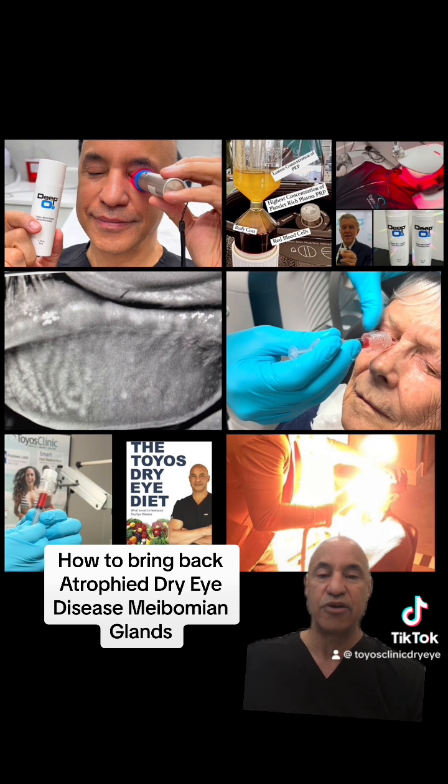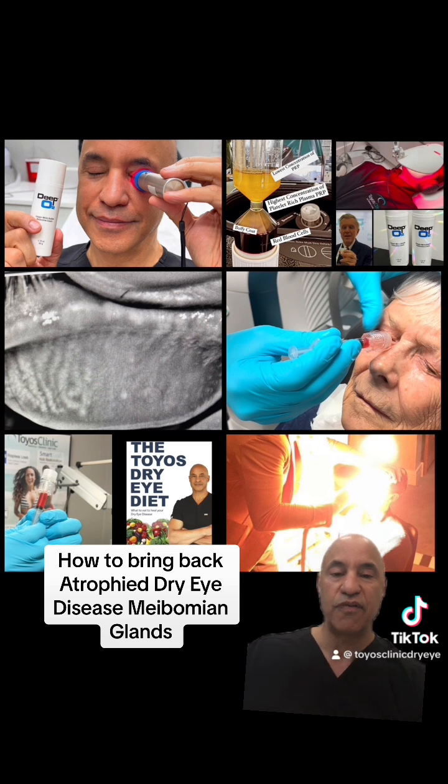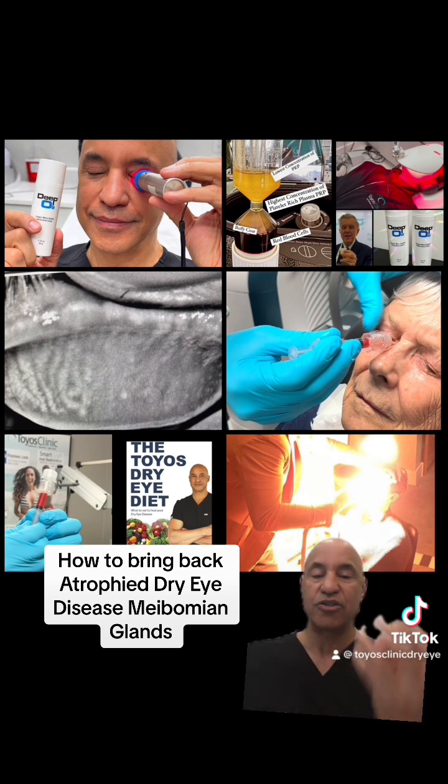The first step is to get energy to them. I do intense pulse light, bringing 10 to 15 joules of energy to stimulate the mitochondria and the cells to come back and work normally. We express these glands to get all of that toothpaste out so that we have a normal gland working.